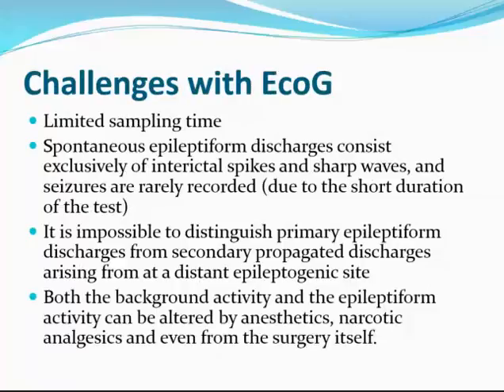However, it has its own challenges, like everything else that we do in the OR as neurophysiologists. We only take it for a limited time, so it is a limited sampling time, and that compounds into the second disadvantage, or challenge, which is that spontaneous discharges consist exclusively of interictal spikes and sharp waves, and seizures are rarely recorded due to the short duration of the test, or intermittent test that we're taking.